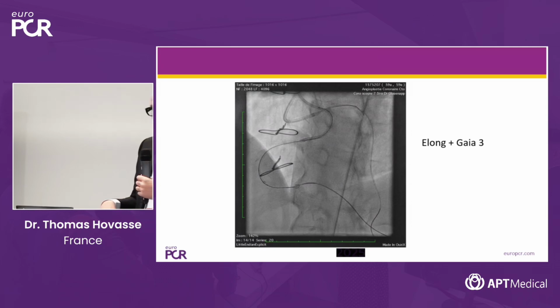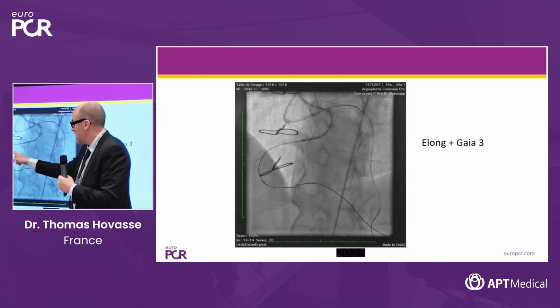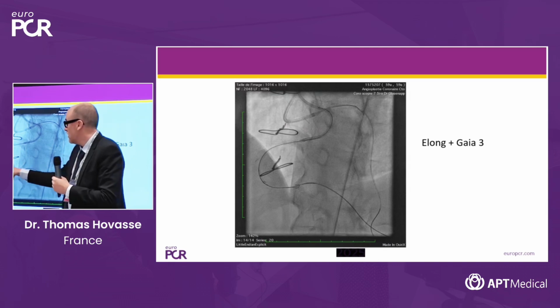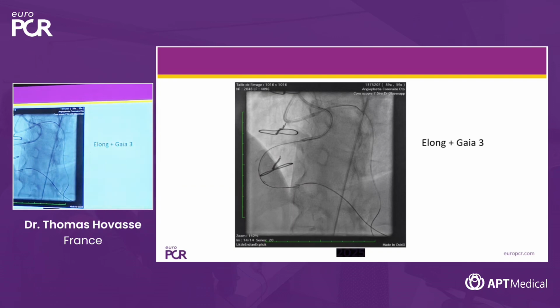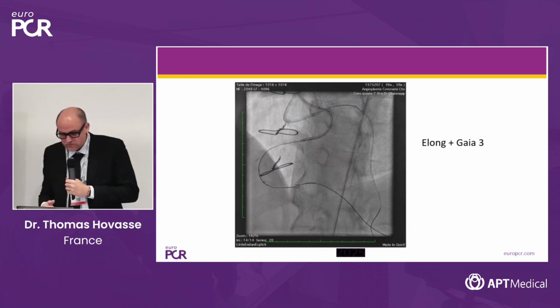So everyone is okay with the concept of the reverse CART, or do you want a small explanation? No, it's okay for everyone? Yes. So one important tip: if you bring an extension, it will shorten the need for going up to the guiding with the micro. So it's very interesting to have an extension to facilitate the externalization. And we aim to do that in most of our cases now.